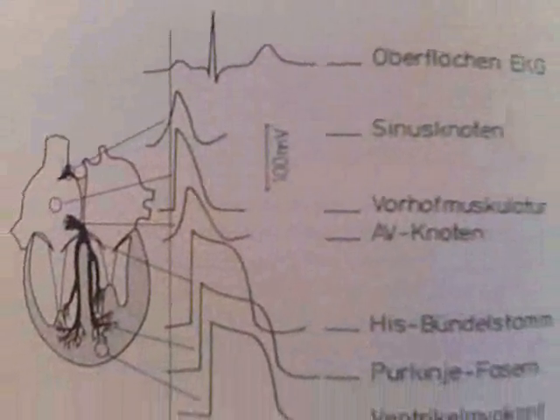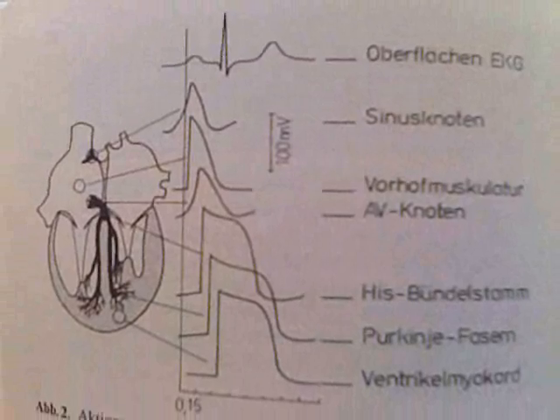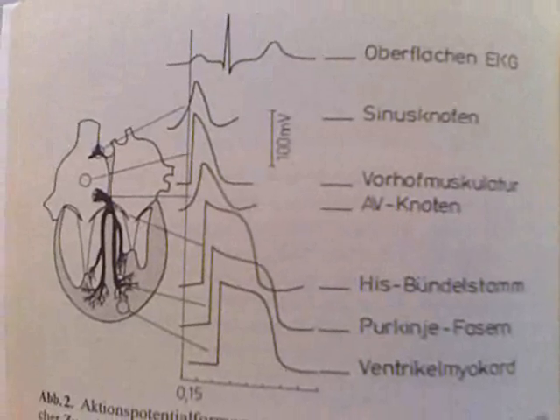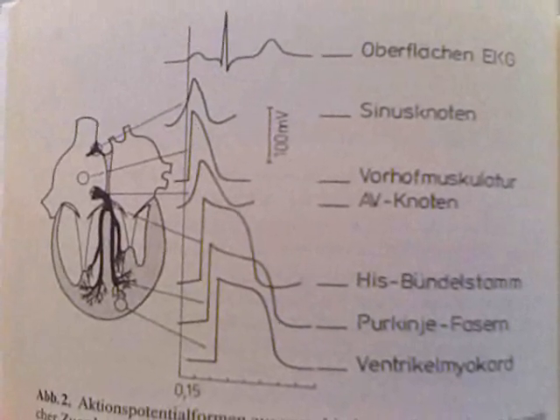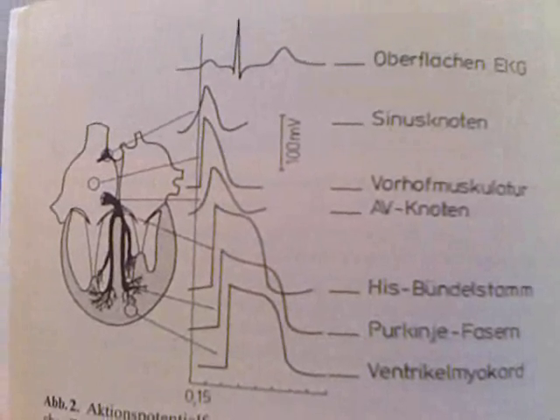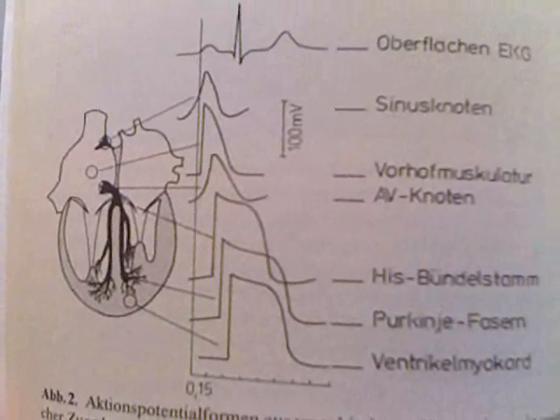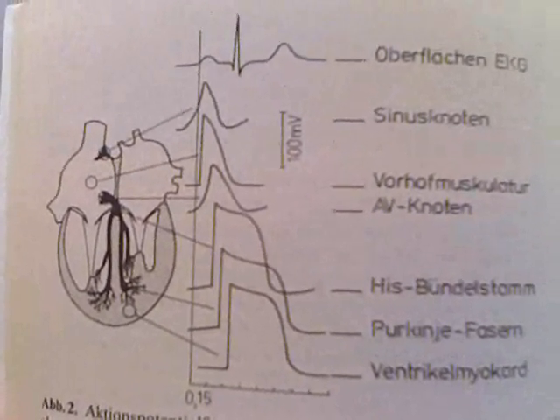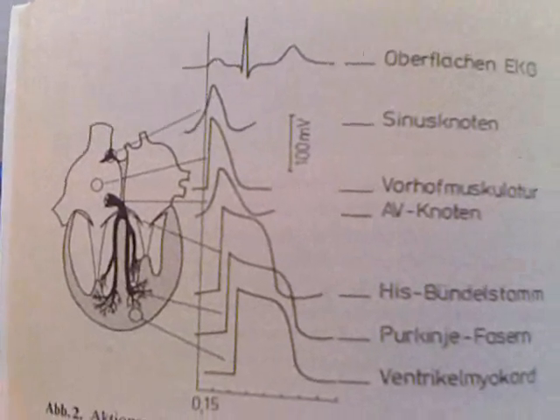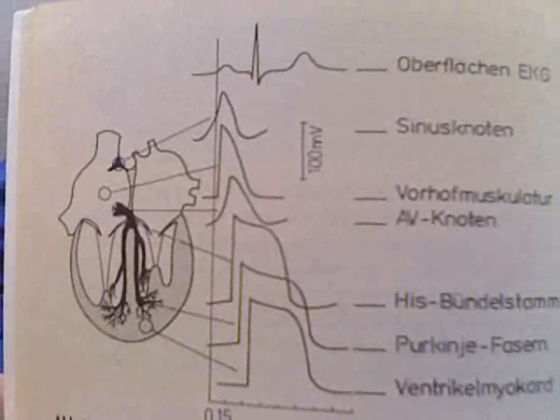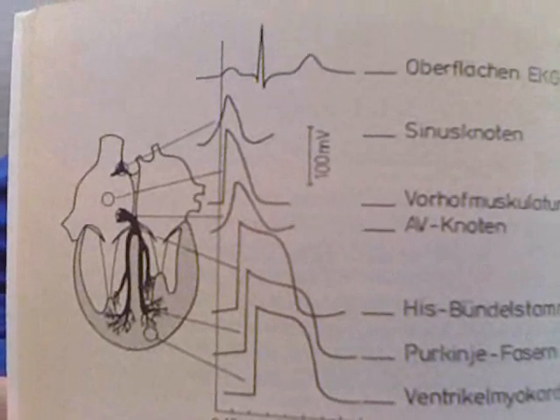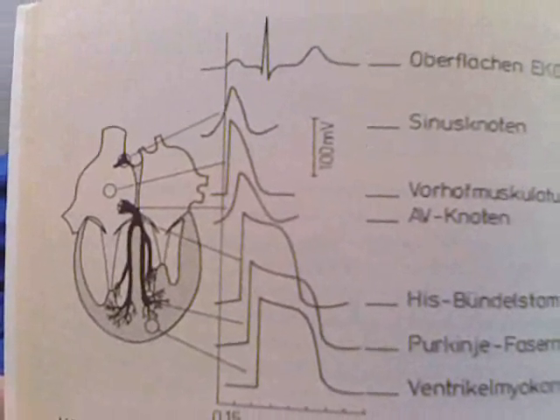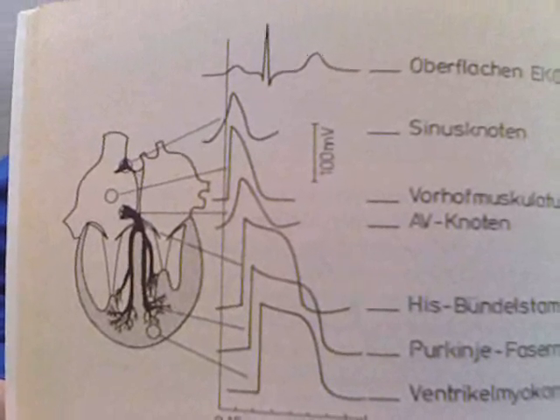I'll get up nice and close. If you look at the top line, you can see a series of electrical waves. If you follow downwards along the heart, these lines depict exactly what part of the heart is being indicated on the EKG at what times. If you follow the first wavelet, that's the P wave — the depolarization of the SA node. Continuing on, you have the QRS, which is the depolarization of the ventricle.